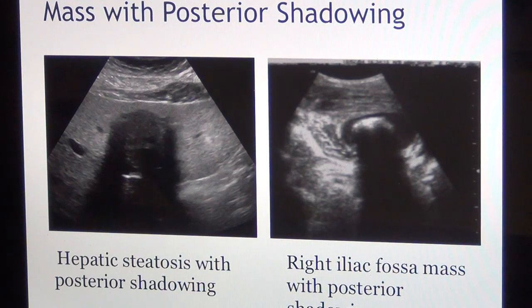Now this type of shadowing, on one hand it is diagnostic and also it is an artifact. Why artifact? Because it does not permit us to see anything behind it. Okay, so now this is posterior shadow. Again, in this shadowing the rate of loss of the beam's intensity is more in this area than in the surrounding tissue. That's why it is darker.